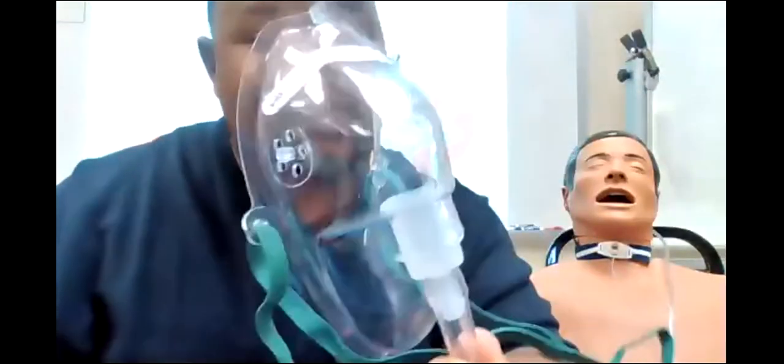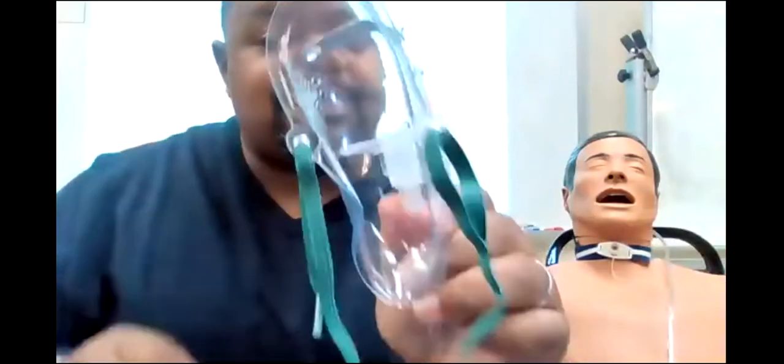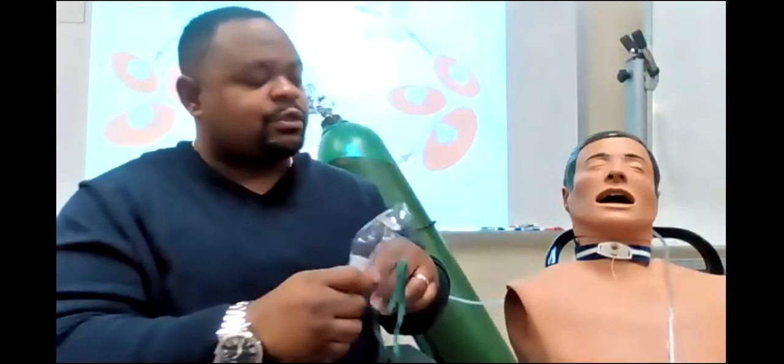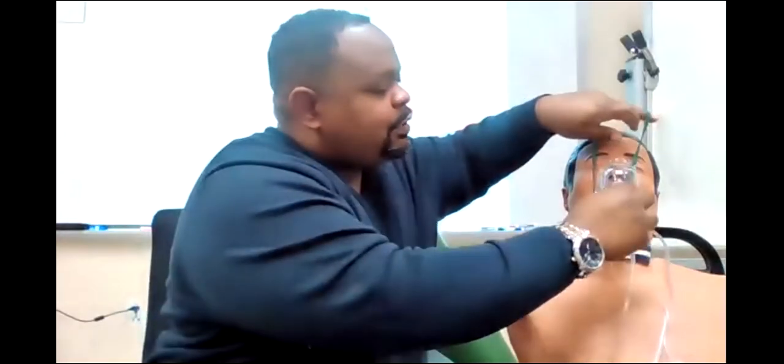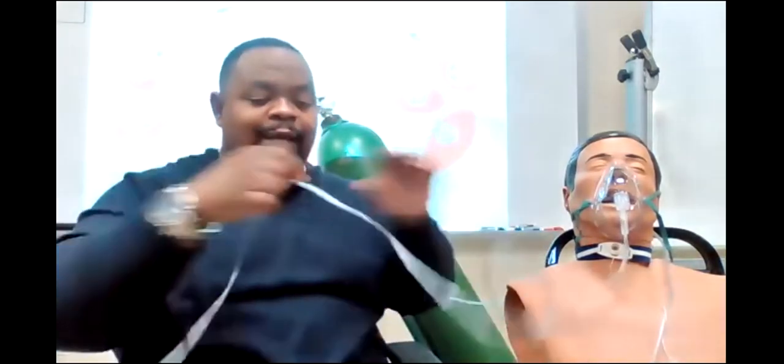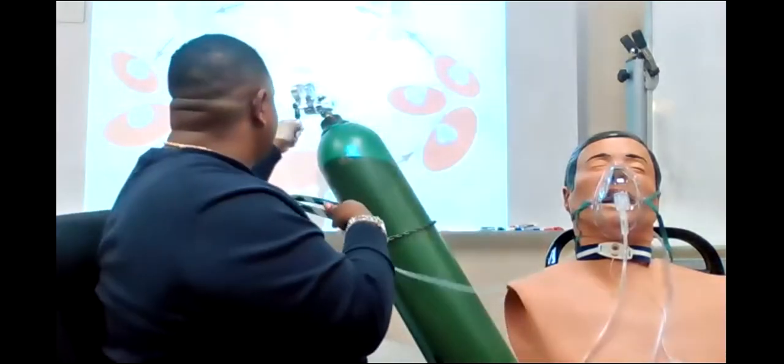So this is a simple. All it is is a small bore tubing connected right to the mask. Simple O2 mask, also known as an aerosol mask, whatever. It's a mask connected to a small bore tubing. This is a simple oxygen mask. Okay? Simple oxygen mask goes on, Mr. Smith, just like this. Put it over his nose, behind his head. You just don't worry about that part. You'll see that in a minute. Simple oxygen mask, go on just like that. I will plug this up to my oxygen source, which is my tank.